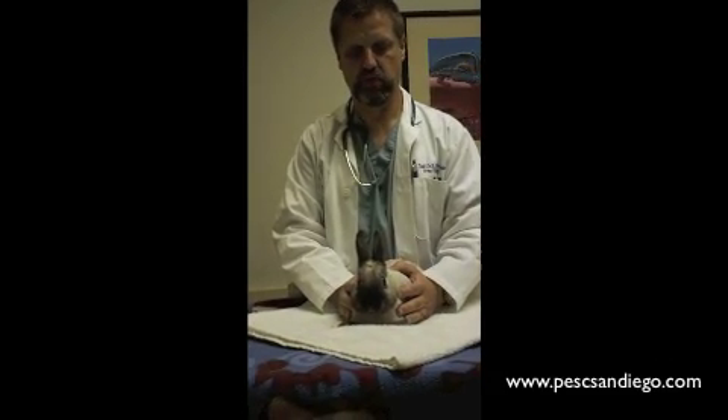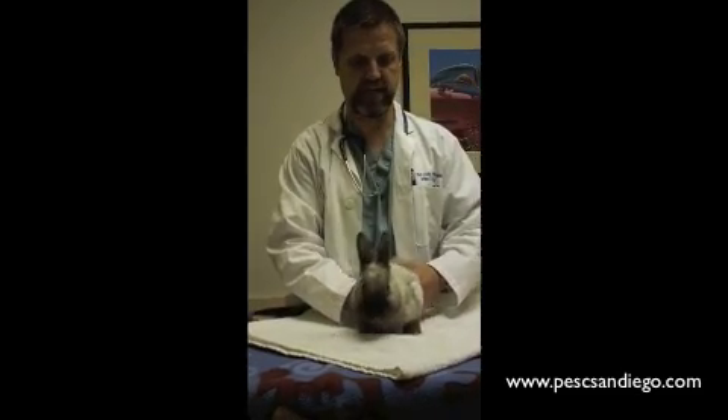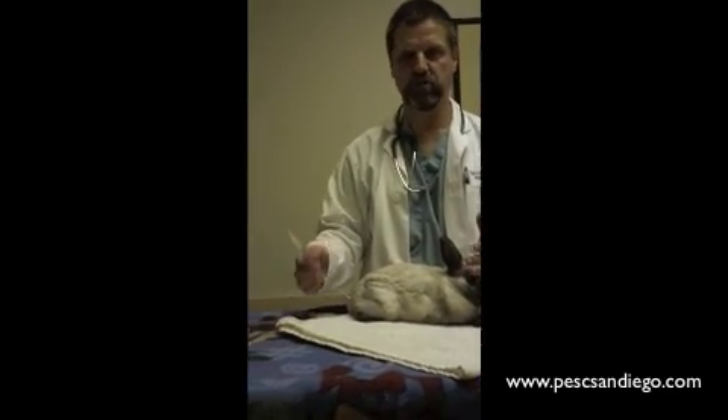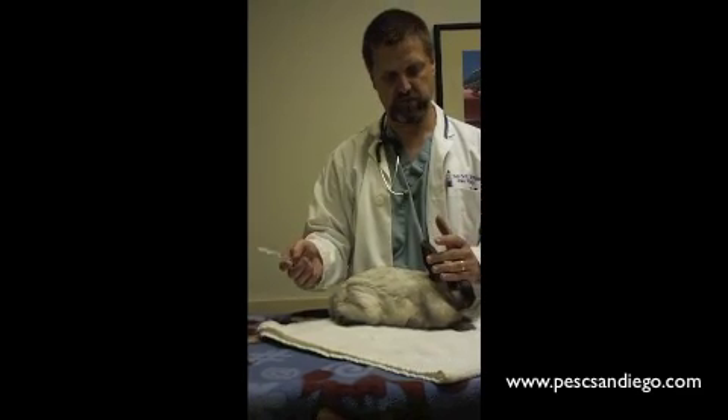This demonstration is to show how to safely administer subcutaneous medicines to a rabbit. It's just like a cat — we're going to give it into the nape of the neck, this extra skin that they have here. Make sure that you measure out your syringe very well with the prescribed dose from your veterinarian.